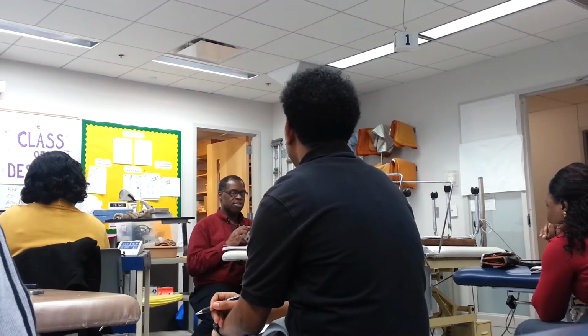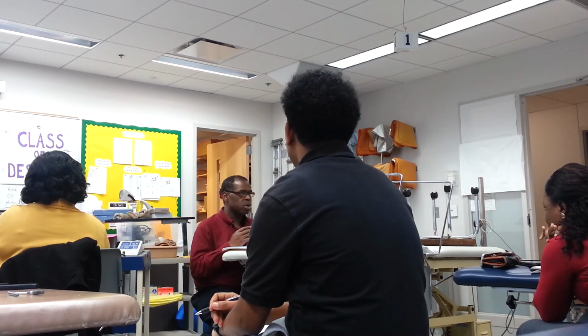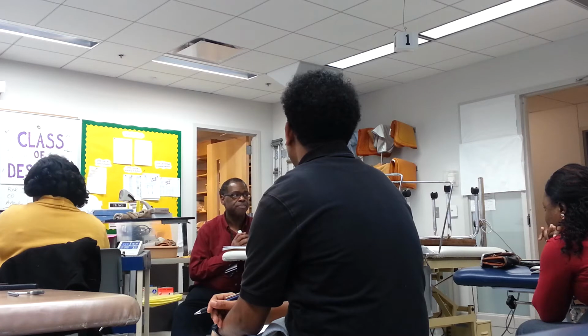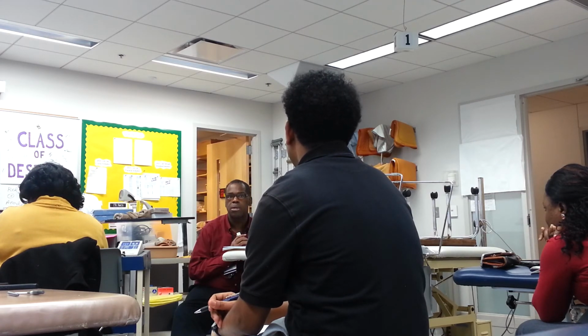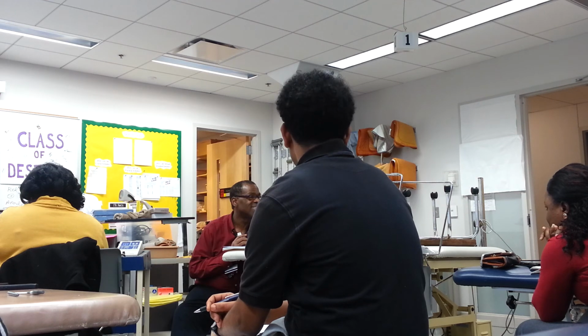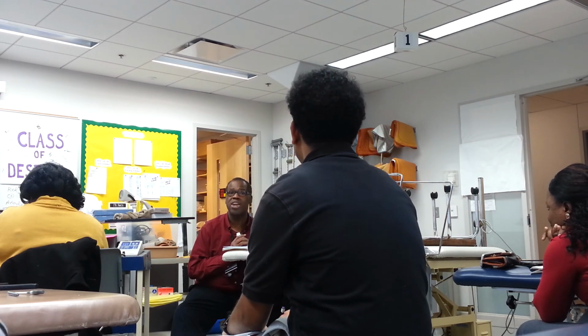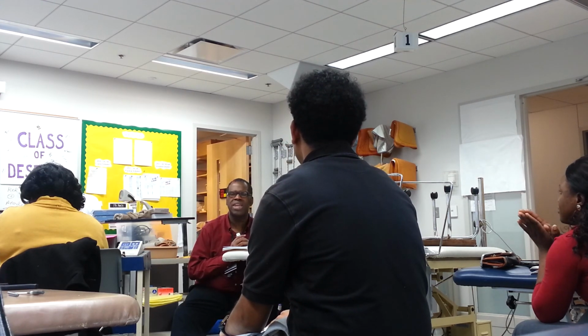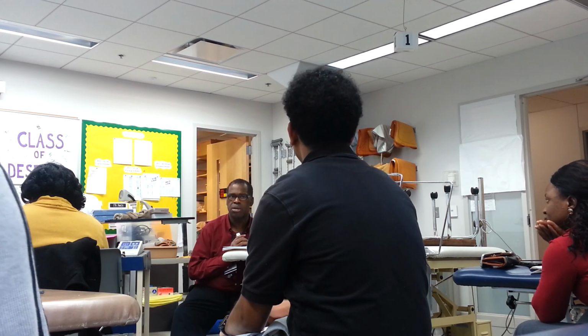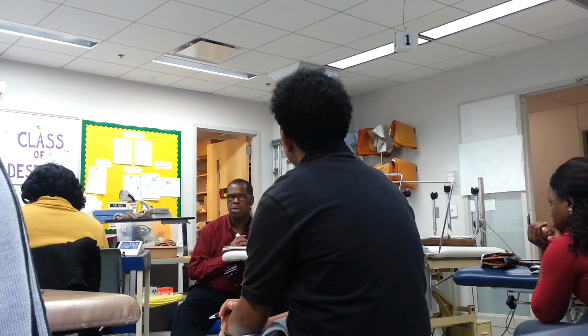All right. Now let's go sit down and get a piece of paper and figure out our parameters for this weakness. Okay. Intensity: motor. Pulse rate? 250. Ooh, it's weakness, right? Pulse width? 250. Pulse rate: 50. 50, not 100? No. If I did 100, it would fatigue. Good. Mode: surge.